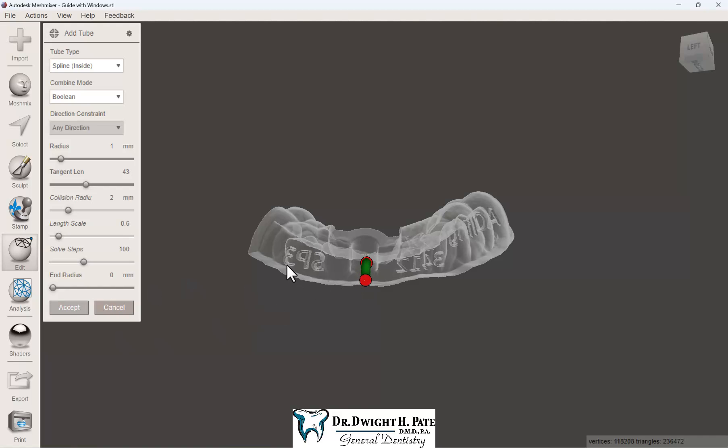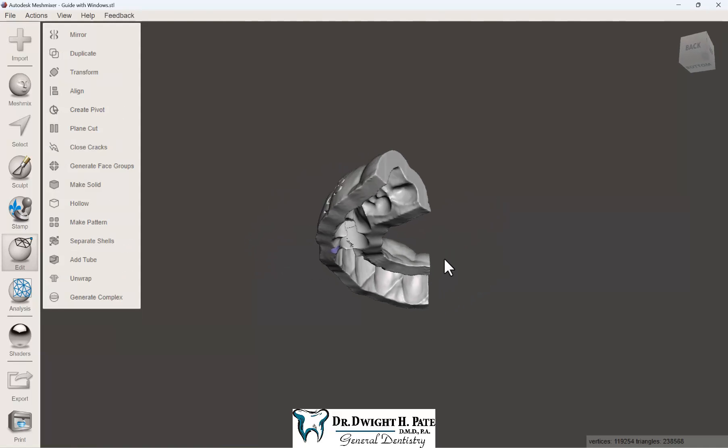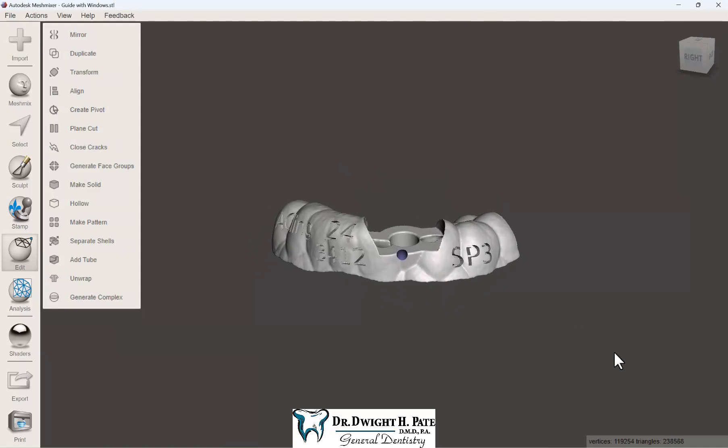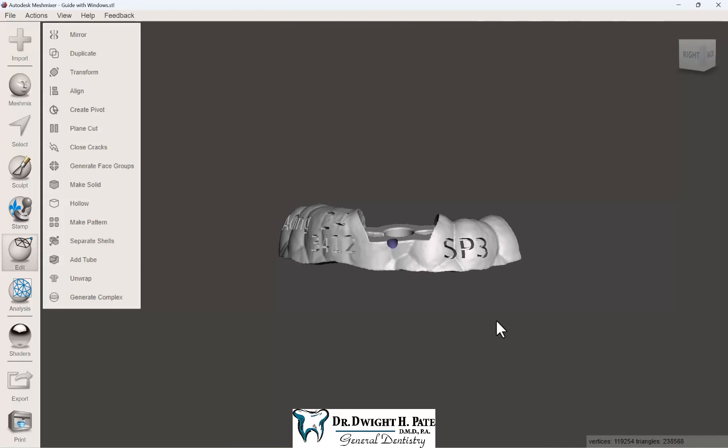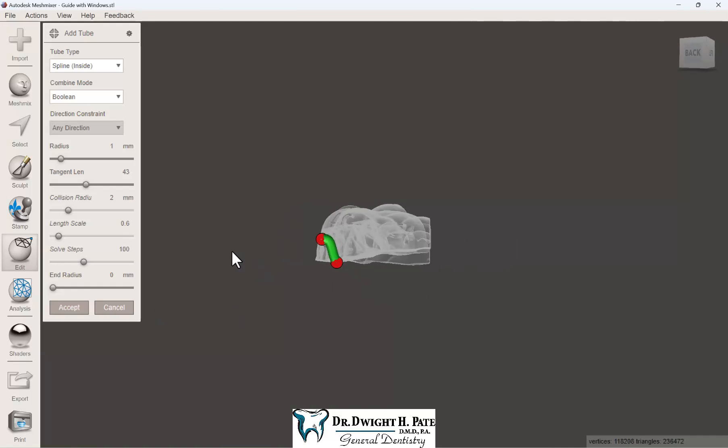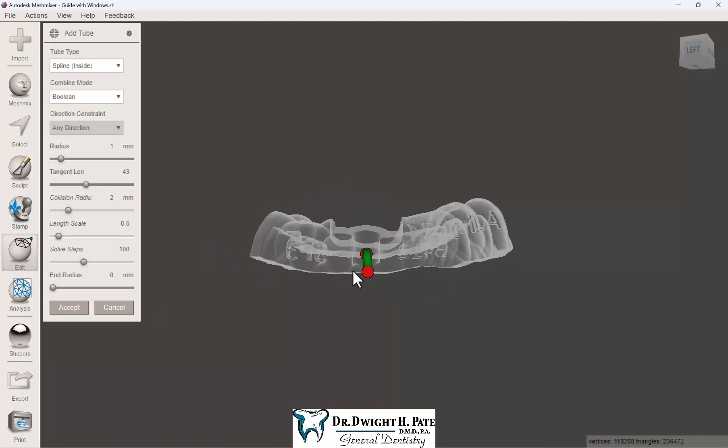Once you accept it, you can see where it's positioned. Sometimes you can't tell when you're putting them on initially, but if this one is too high on the outside, just do Control-Z to back up and adjust them a little bit.